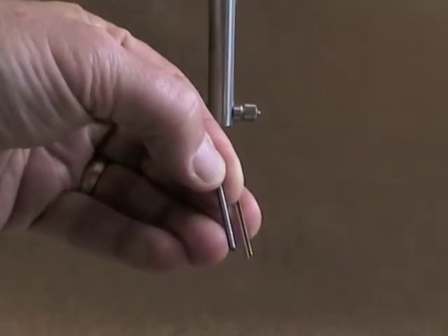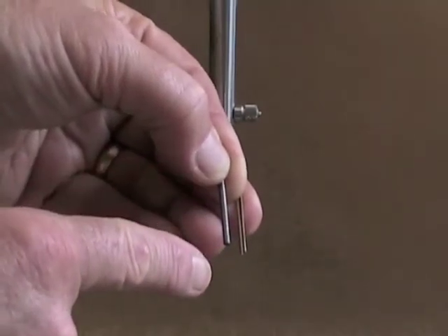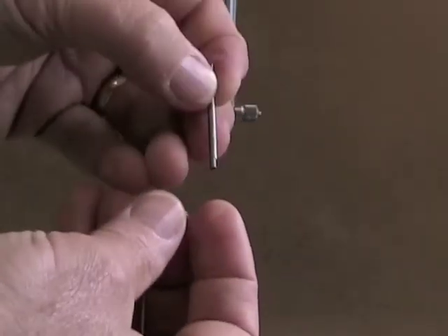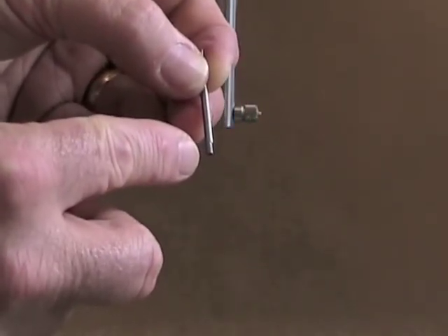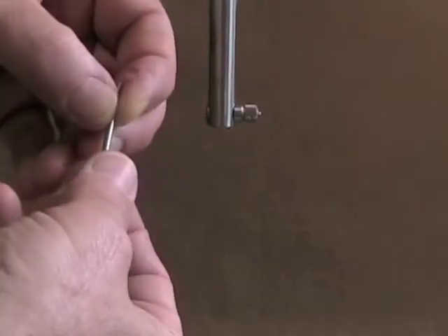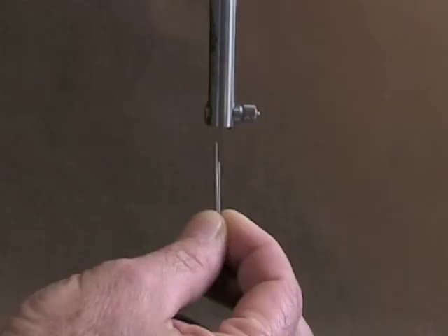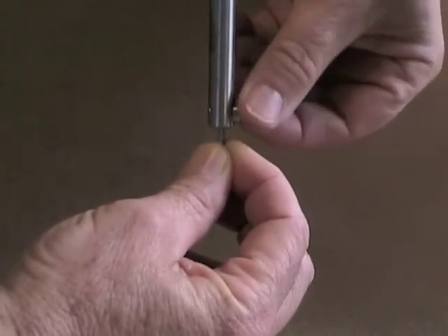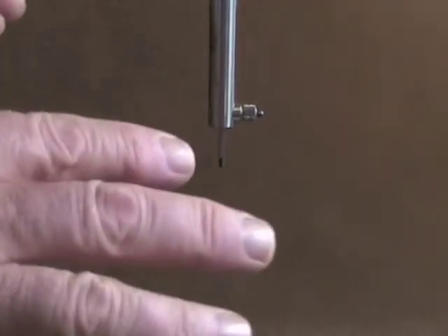The last surveying tool is the carbon marker. It comes with a piece of carbon and a metal sheath. When placing it into the surveyor, position the carbon marker slightly below the metal sheath, and orient the metal sheath on the opposite side from the knurled nut. Tighten it just enough so the jaw holds the metal without breaking the lead.